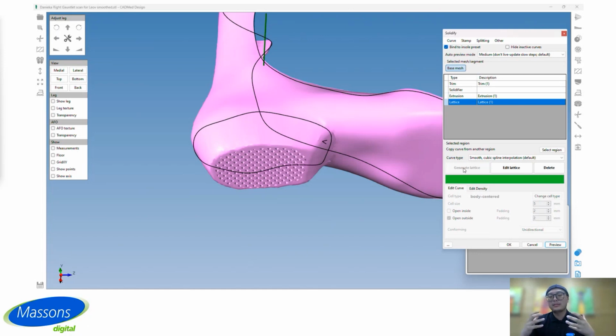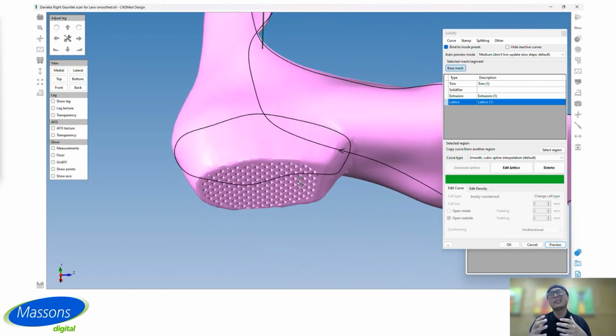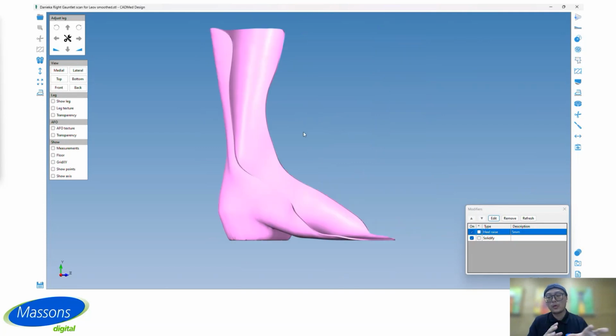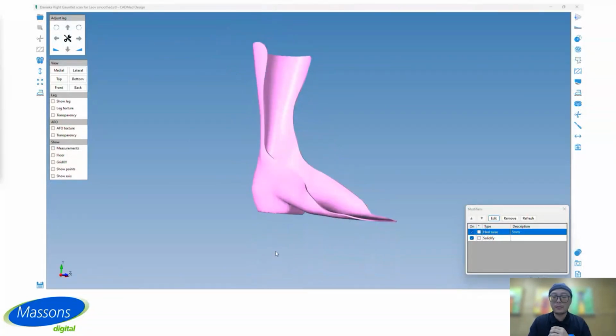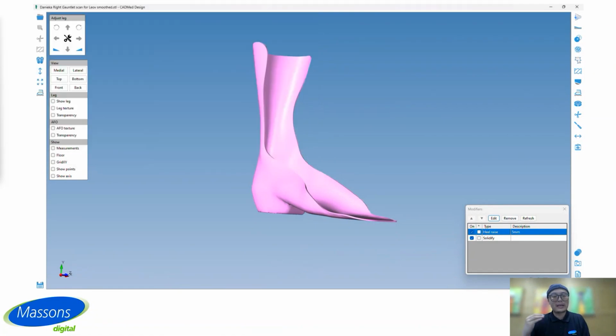The waiting time depends on the ability of your laptop, but it's normally around several seconds to 1 minute. So finally, the result is pretty good. We got a very cool lattice structure while reducing the weight, and this lattice structure also can help us lower our printing costs as well. And it's ready to export and print in the printer. Awesome.